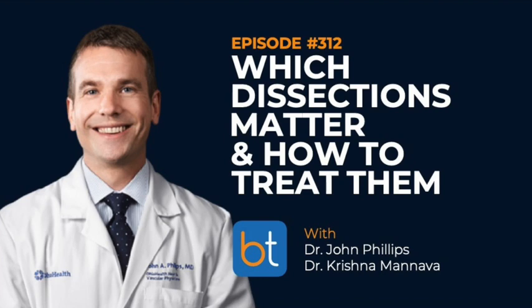A lot of times I get asked, is it really a bailout? And I don't know that it's a bailout. It's just another option for treatment. When we were talking, Krishna was asking me, do I do anything different to prevent dissections? Obviously we do atherectomy and whatnot, and I try not to get too silly with ballooning, but I think IVUS really helps us gauge the true size of that vessel. For me, it allowed these devices, and I didn't mean for the whole conversation to be about TAC, but it allows us to get more aggressive, at least in the tibial vessels, with treating these long CTOs.